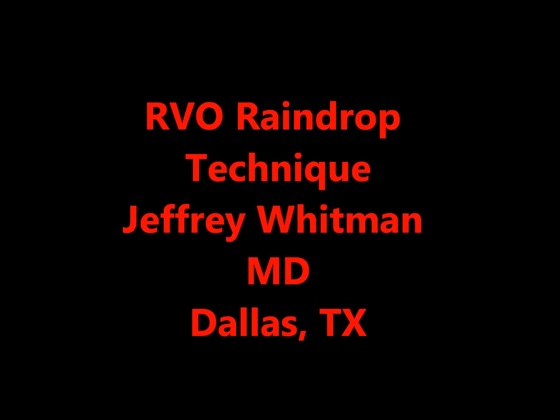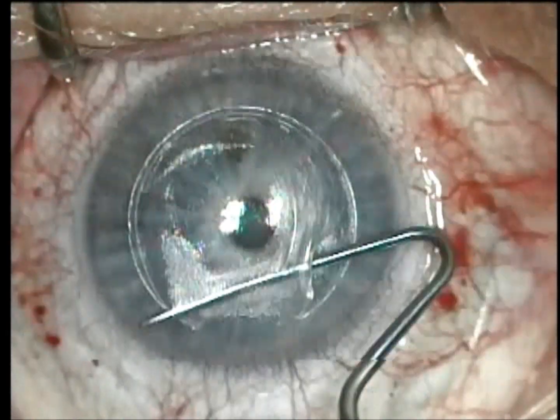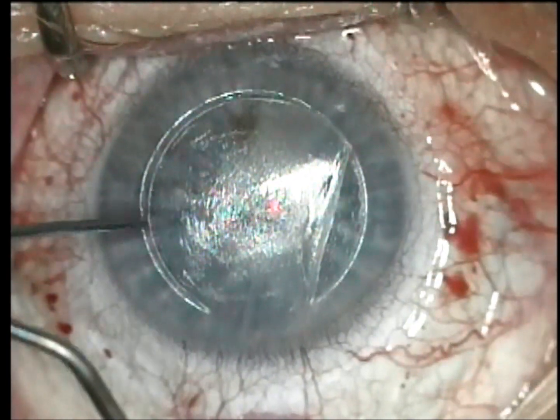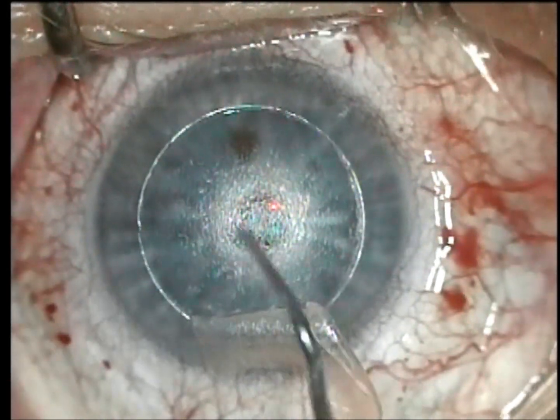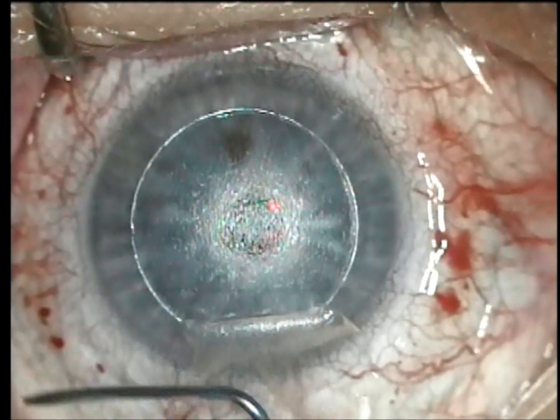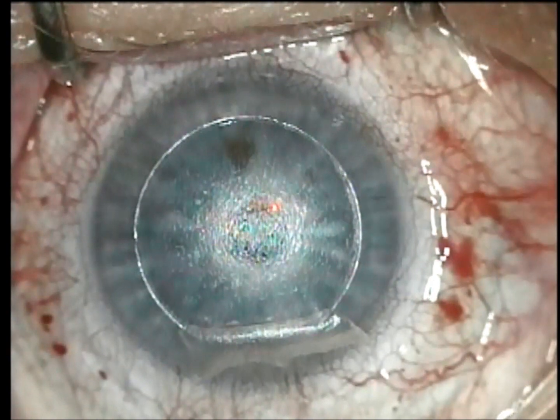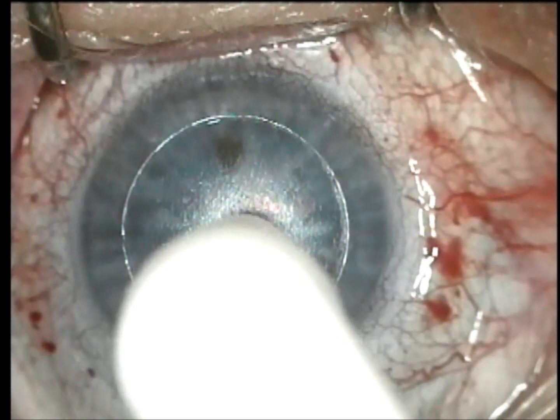This is Dr. Jeffrey Whitman describing the technique for RVO raindrop insertion. First, I make a nice 150 to 160 micron flap. I'll check this with ultrasound, lay that flap back. It's always made with a femtosecond laser — this one was made with an Intralase. I measure the thickness by difference.